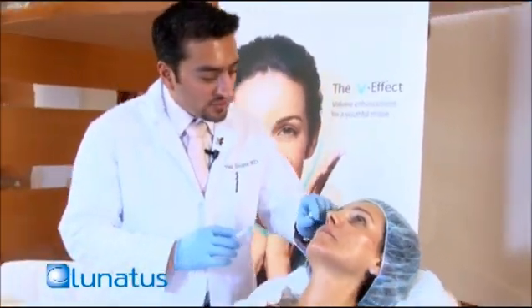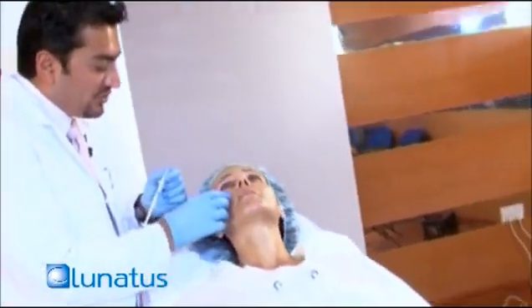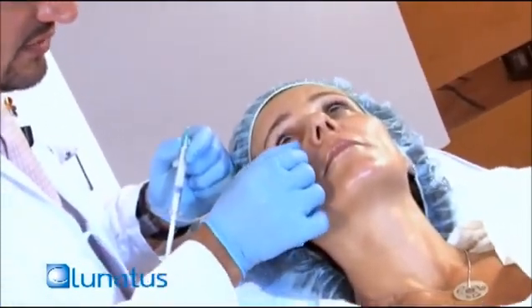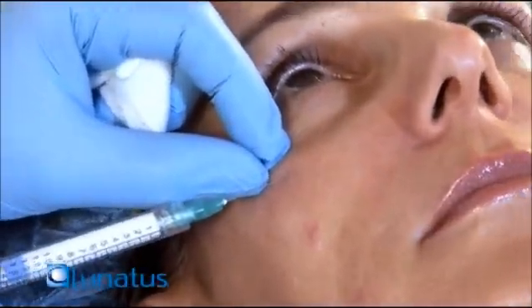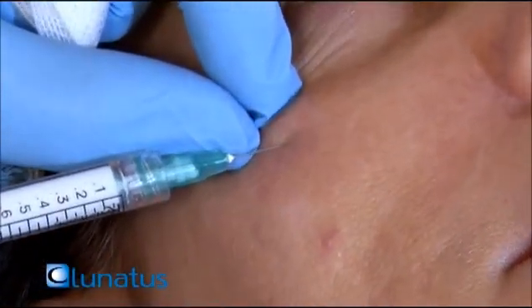Okay, so we're going to treat the hollowness over here, and this technique is going to be a little bit different than the previous one. I'm not going to approach her from the center because her cheeks are completely fine. She just has a little bit of hollowness mainly on the sides. So we're mainly going to be injecting right on top of where the hollowness is, where the defect is, and we're going to be doing the bolus push technique.